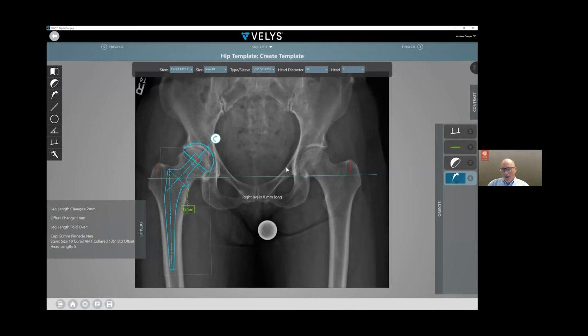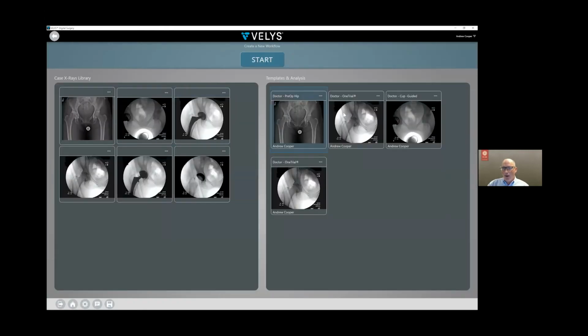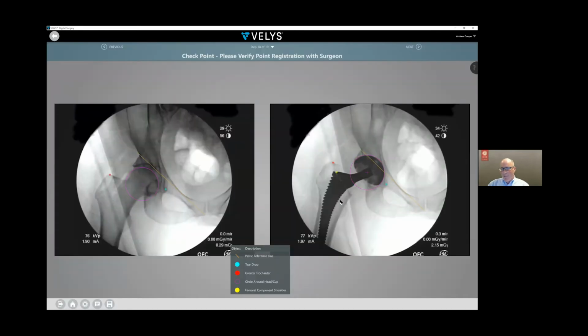We all know what kind of x-ray we're trying to get in the office and what kind of patient satisfaction we want. Having x-ray in the OR can allow you to achieve that if you can understand the subtle perceptions that can happen with fluoroscopy, and technology can help you do that. So fast forward to the same sort of case in the operating room, and I can go over what actually happened versus what I planned.